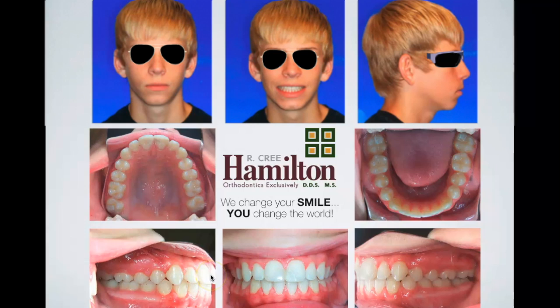so that everything extrudes as a unit. And then you also have to know that as those teeth come down, they're going to be coming down and back, which is, in a sense, going to put them in more of a Class 3 relationship almost, because the lower jaw doesn't know what to do. So you'll want to run a light Class 3 elastic on both sides as well, which does two things. Let's say you run a 4-3, 4-3 on both sides. A, it's going to help with the extrusion of the premolars to keep up with the anterior teeth. And B, you're going to have a slightly retrusive force on the lower anterior teeth to keep your occlusion good while you're doing that process.